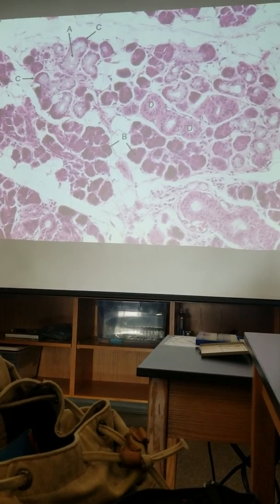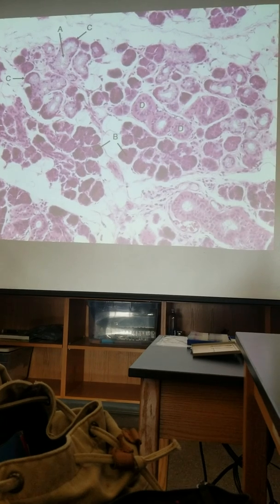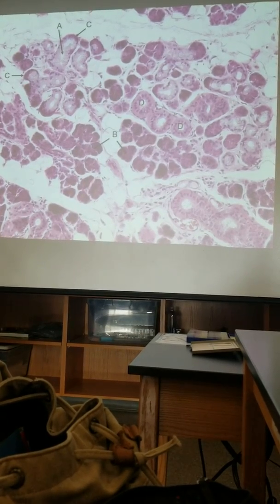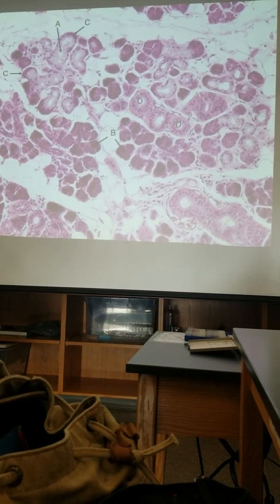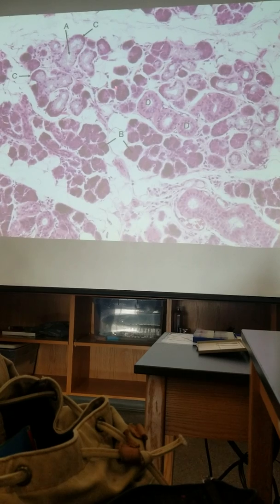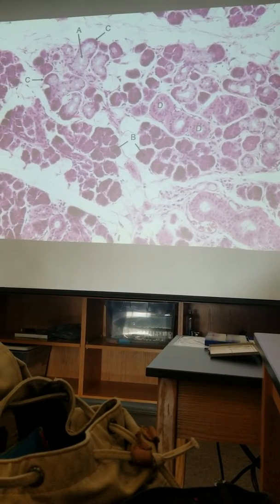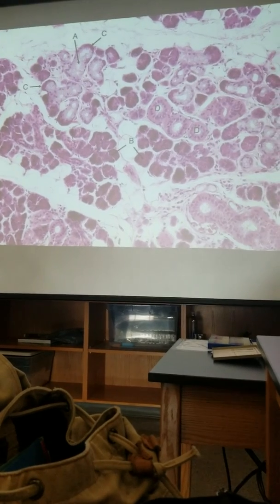If you were to say secretory duct or interlobular duct, I would have to say no. Okay, so duct, striated duct, intercalated duct, all good. Oh, and then because we got this mixture, it tells you that we're in what gland? Submandibular or submaxillary. Yeah.